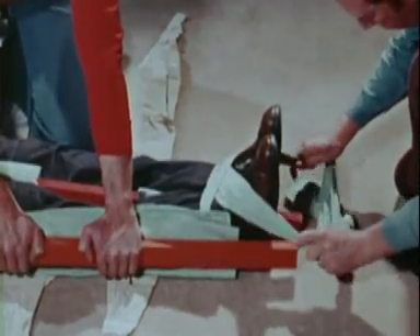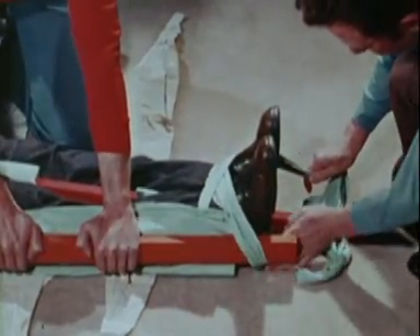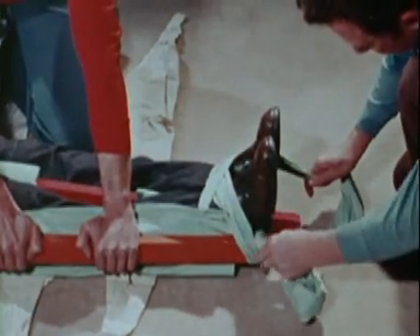Untie the first bandage from around the ankles and feet and tie it again to hold the bottom of the second splint.